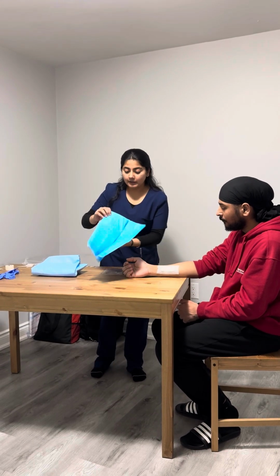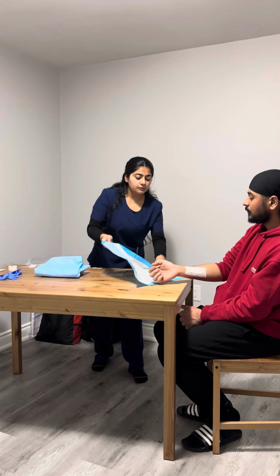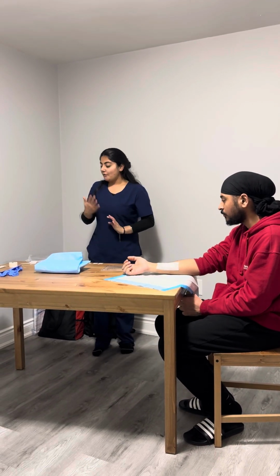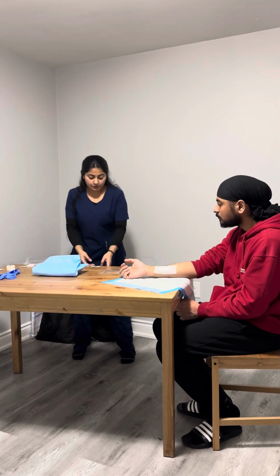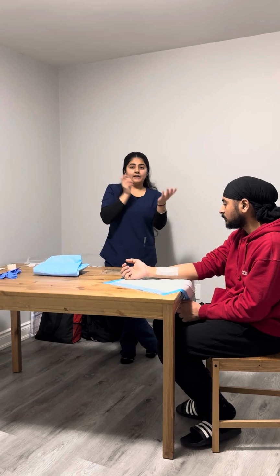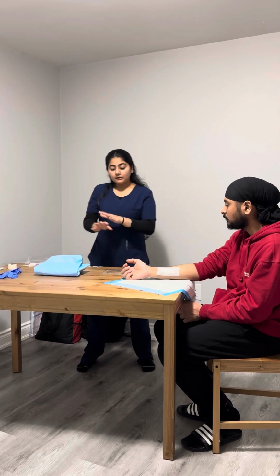Okay, so as I have done hand hygiene already, I'll give the blue sheet under the wound area to make sure there is no spoilage of anything. Perfect. Okay, and then I have already made a garbage bag here, which I'm going to use while doing the procedure. I already took 4 tapes to make sure that I can secure the dressing afterwards. I have a little piece of tape as well to write down the date and time for the dressing. I have all the things already here, so next I'm going to do the dressing.